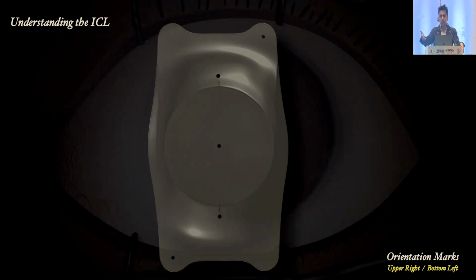And the disclaimer is that 99 point whatever percentage you can think about do go well. So whatever we're discussing here is a very, very small fraction, but it's something that we all should know about in our daily practice if we are going to get into phakic ICLs at any point of time.